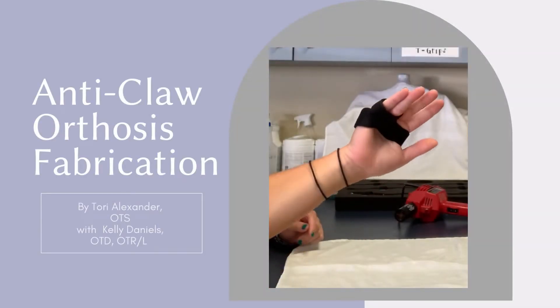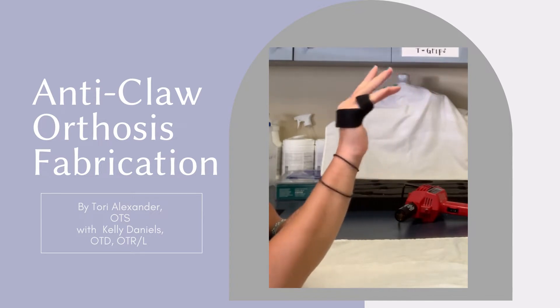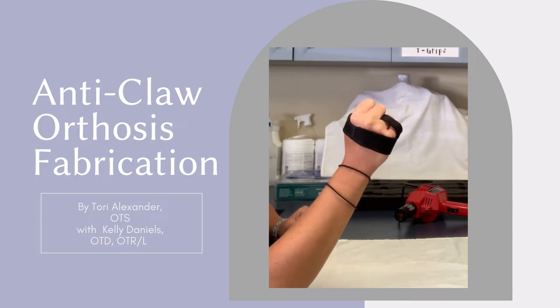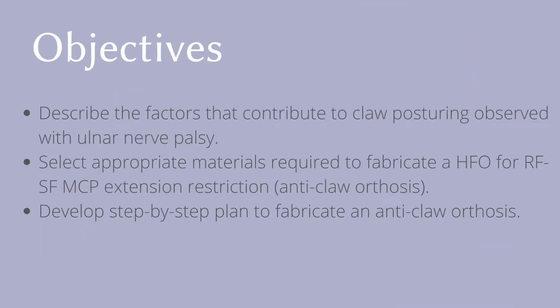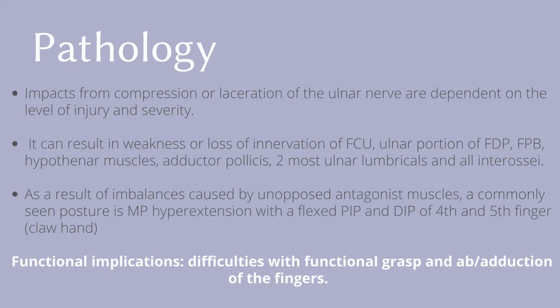The focus of this video is fabricating an anti-claw orthosis, otherwise called a hand-finger orthosis, for ring finger to small finger MCP extension restriction. Following this video, viewers should be able to describe the factors that contribute to claw posturing, select appropriate materials required to fabricate this orthosis, and develop a step-by-step plan to fabricate the anti-claw orthosis.